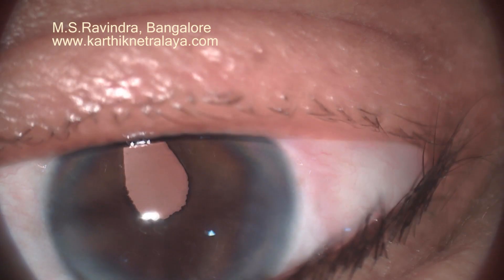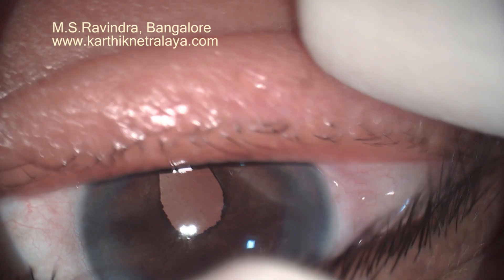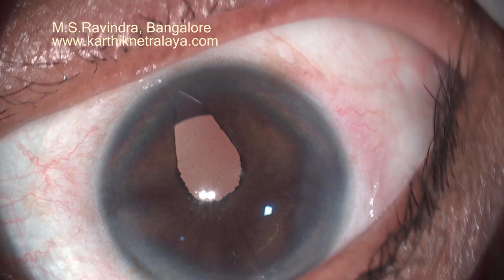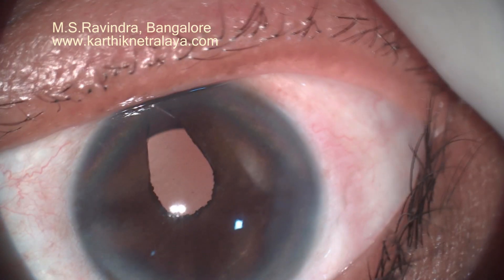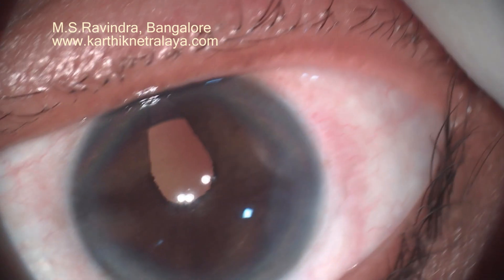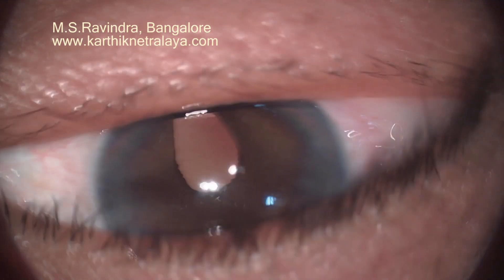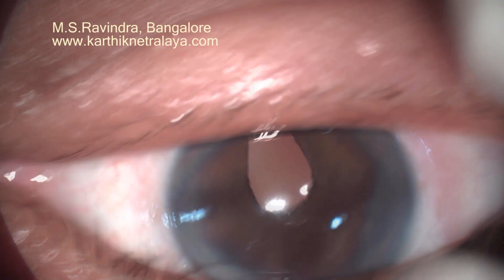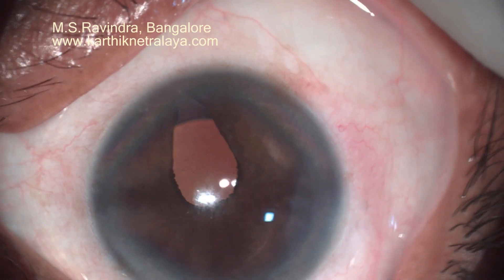This is the other eye which was operated two days ago. You can see that the haptic base is occluding the coloboma and the patient had much lesser glare. Also note that the visual axis, the Purkinje image, is within the pupillary zone. If the iris had blocked that area, I would have made a small sphincterotomy in the occluding area. A photograph of the eye taken preoperatively would be of great use during surgery.